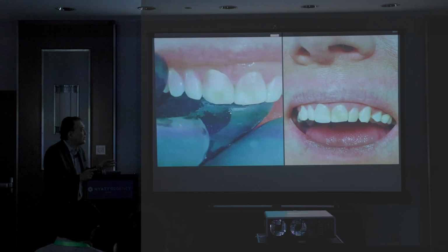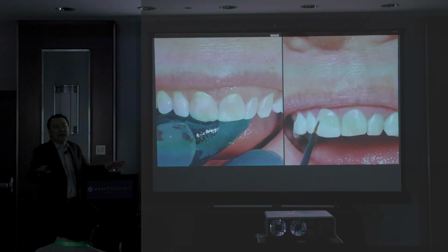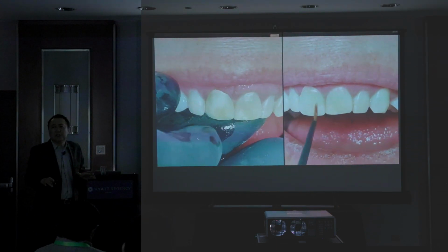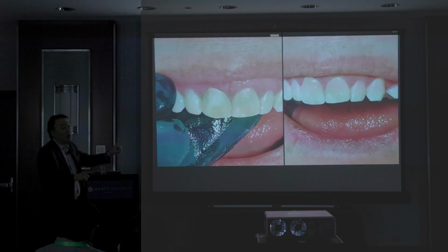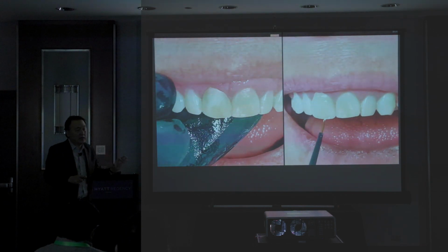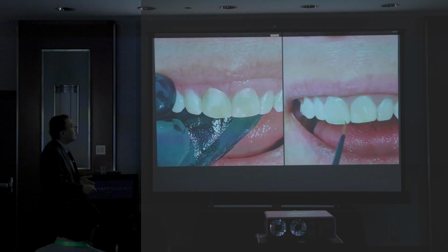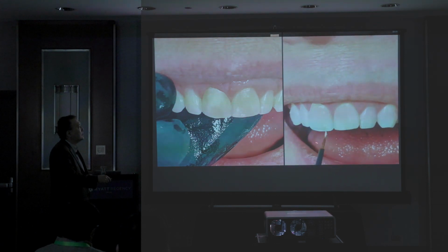But that's my guideline for Asian teeth. You have to know hydrated and dehydrated. Some people are fast to hydrate. That means you don't see much color, just like vapor, just like cloud. But once you come back with saliva layered on, then you can see some color. So that one is another concept, see? Then I can tell.